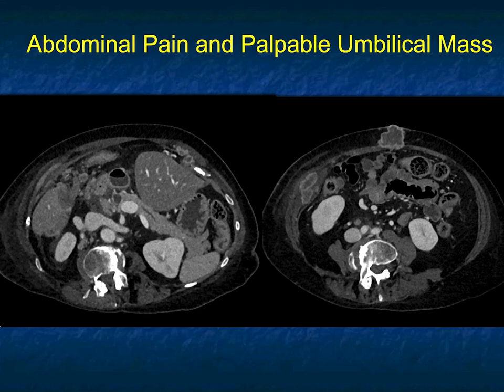You then try to figure out what's going on. There's tumor in the liver, there's tumor around the liver. What this was: gallbladder cancer invading the liver with peritoneal metastasis and Sister Mary Joseph nodules. What a great case.